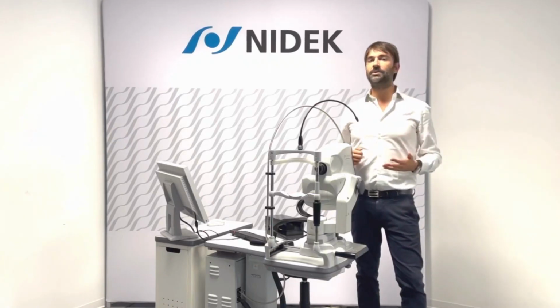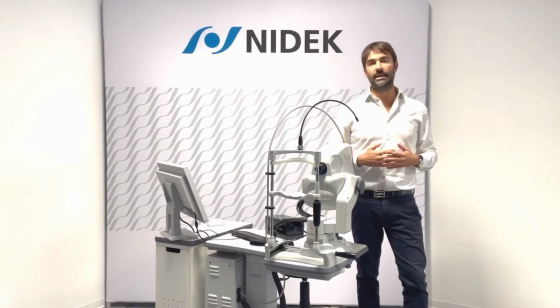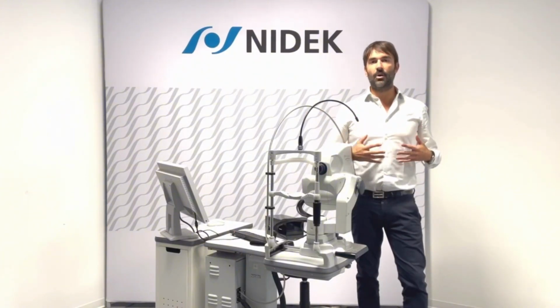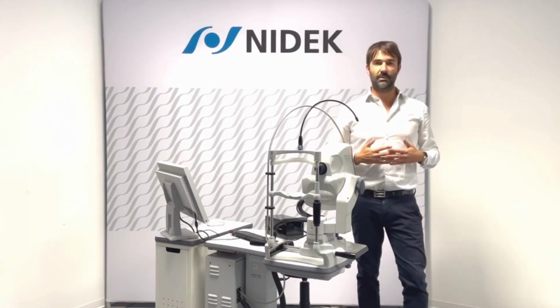Today, I'd like to introduce you to NIDEK Mirante, which in my opinion is the pinnacle of more than a decade developing high-quality retinal imaging technologies, now finally fully integrated into one single powerful multimodal imaging platform. So let me show you what Mirante does and how it works.